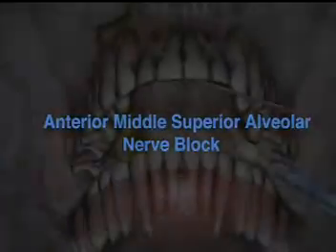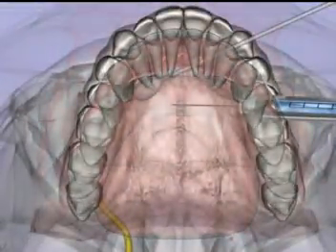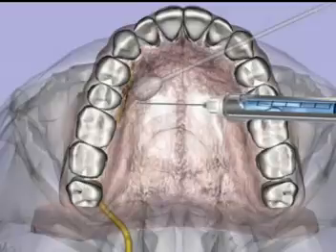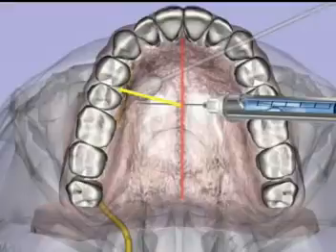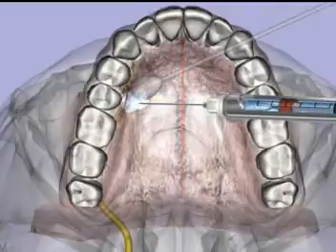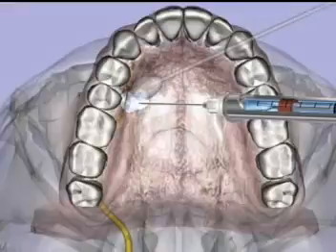Anterior middle superior alveolar nerve block: a 27-gauge short needle is inserted into the palatal soft tissues about halfway along an imaginary line connecting the mid-palatal suture to the free gingival margin between the two maxillary premolars. Bone is contacted, and after negative aspiration, approximately 1.4 milliliters of local anesthetic is very slowly administered.